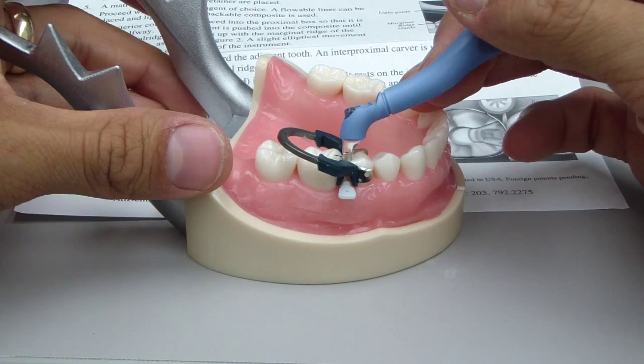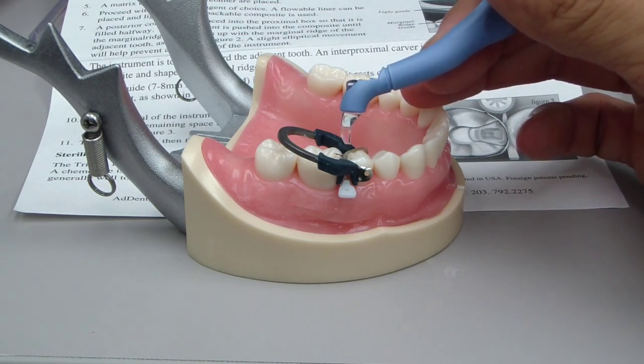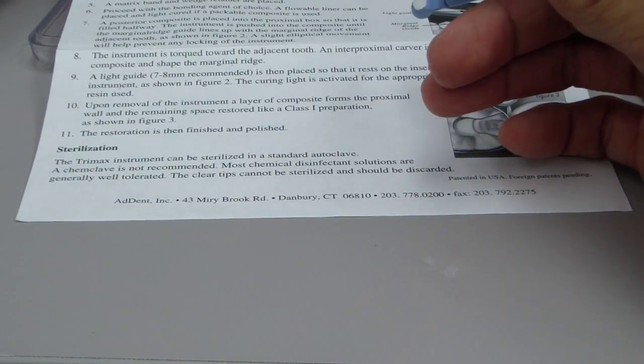So I used this yesterday and I did exactly that. Then I stepped back and thought, is there light actually going — being transmitted through this thing? Well, let's find out.